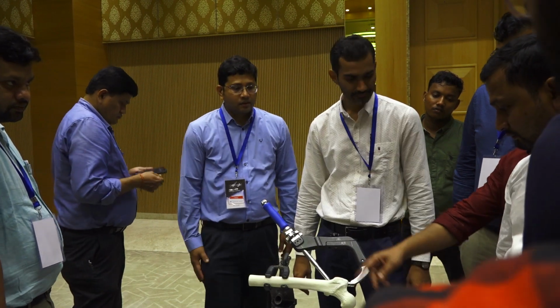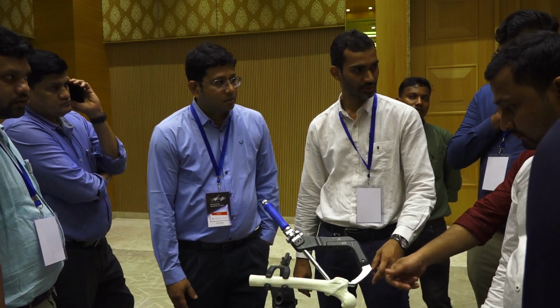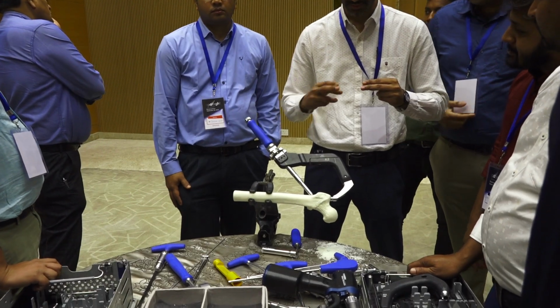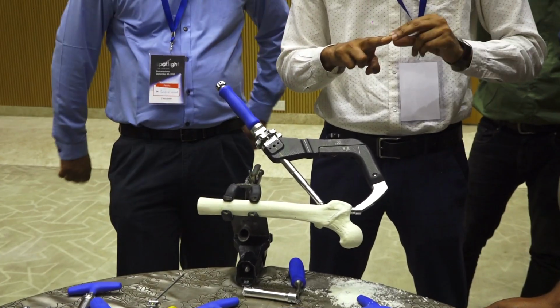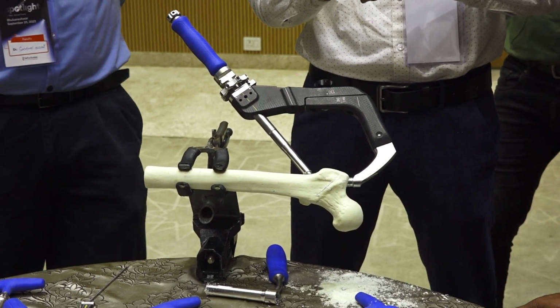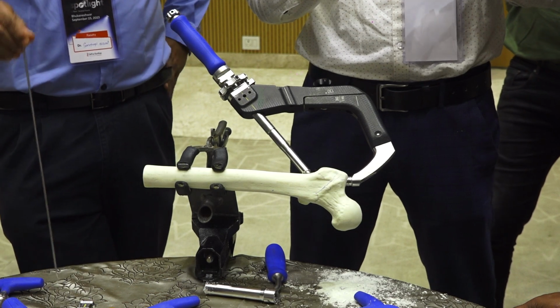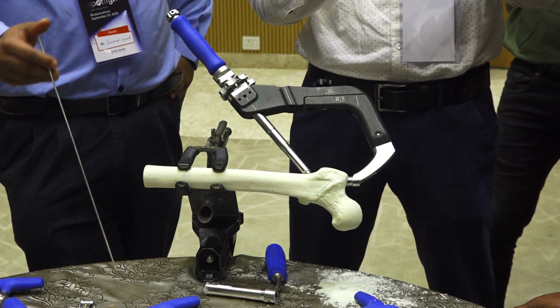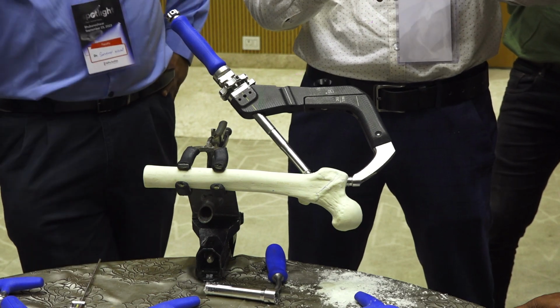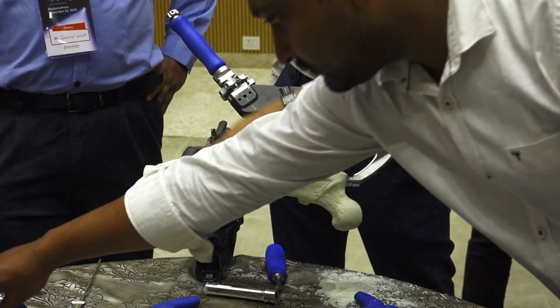Can you do this step after this one? Which step? This one. Set screw? No. You have to, because this is the nail, the set screw and helical blade. It is away. So you have to go. You have to rotate it to that level, then slightly rotate it backward so that there will be a compression effect. And after compressing, you can either leave it like that in a dynamic mode, or you can again tighten it to a static mode. So for final tightening, you have to take the solid screwdriver.